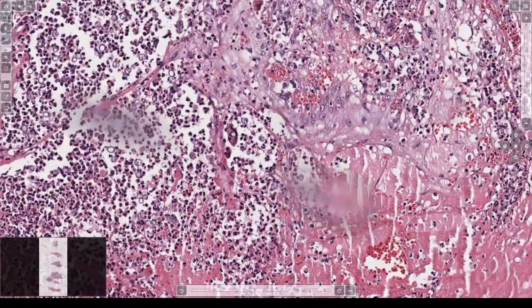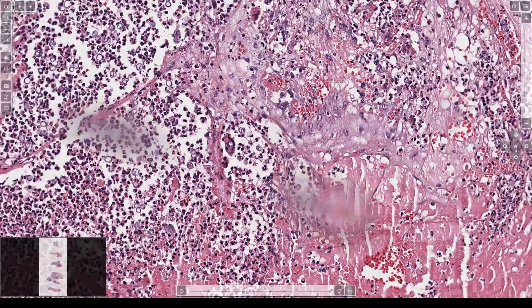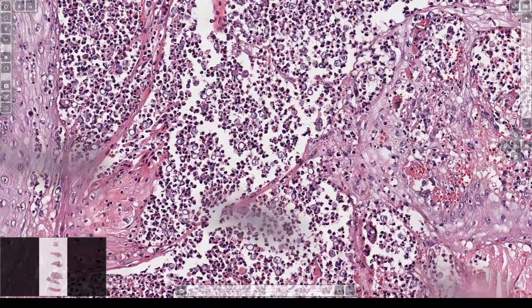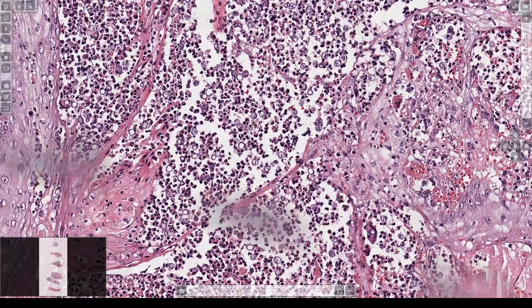There's another place over here that is a little bit better. You can see them kind of floating in the background. Here's a large yeast, and here's another large yeast right here. They're budding — broad-based budding. They're big, round balls of yeast, relatively uniform in size, with buds coming off. Instead of a tiny, narrow-based bud, they have these big buds.